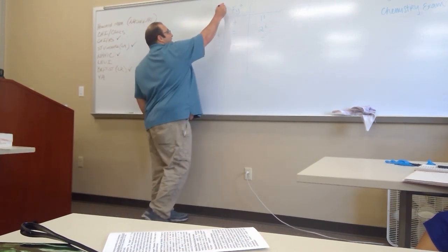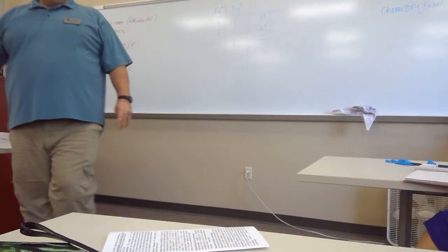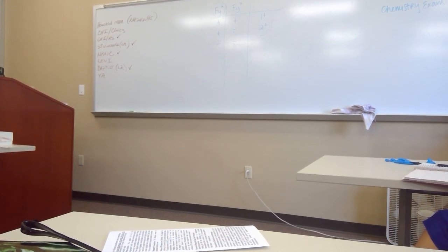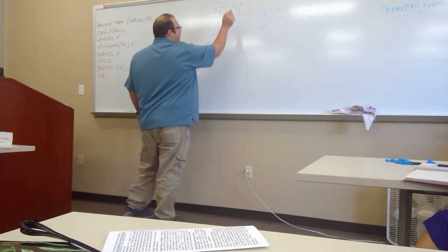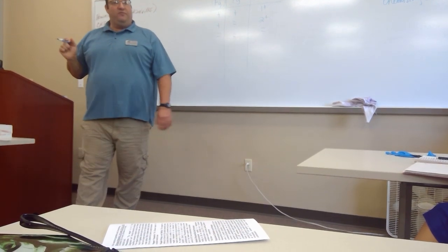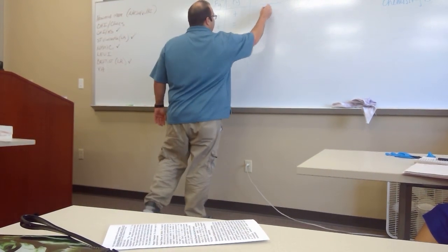And again, this is our antibody. Once we ruled everything out, it was the Duffy A. So when the Duffy A and the Duffy B both occur on the cell, it'll be a weaker reaction. Think of it as these two are competing for space on the cell. So when you have a bunch of Duffy B, there's not as much room for as much Duffy A. So you get a weaker reaction.